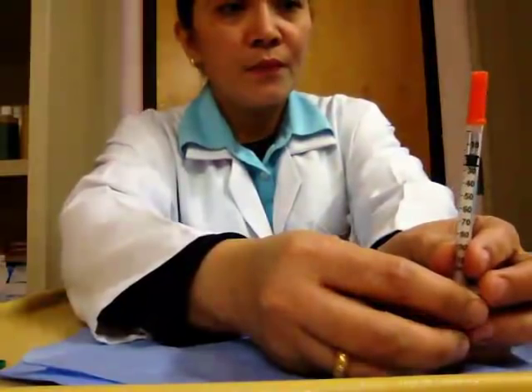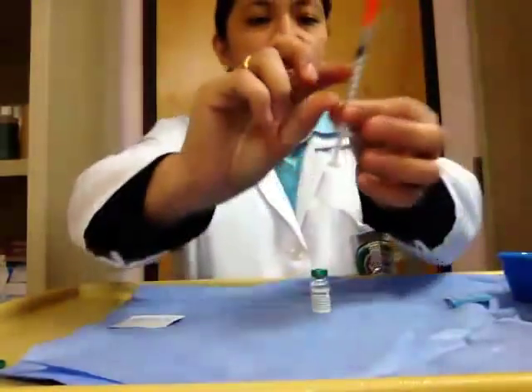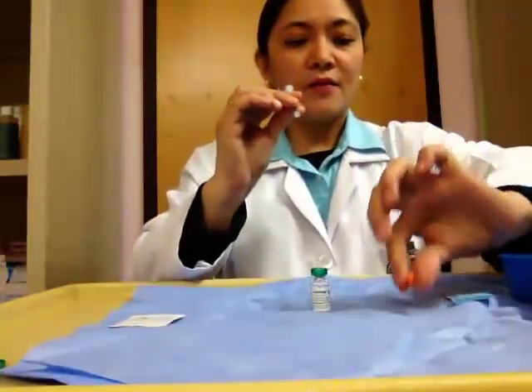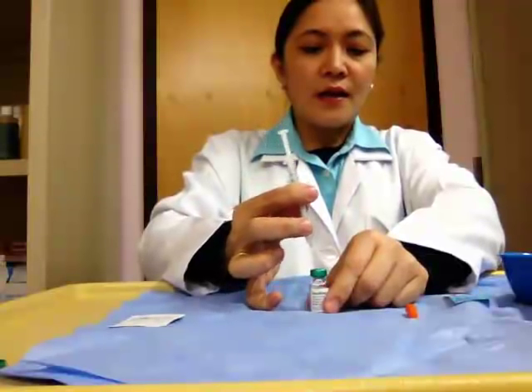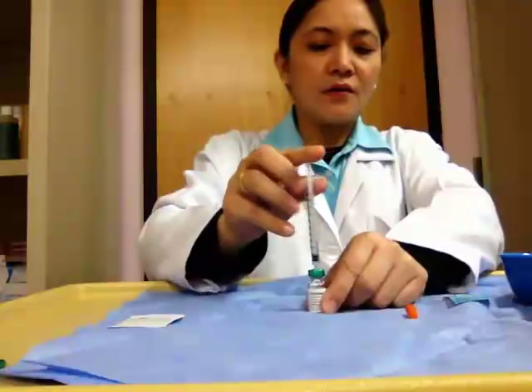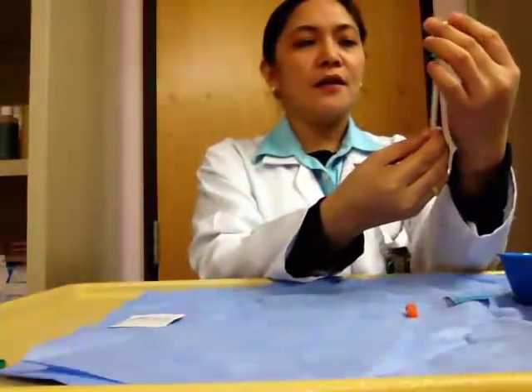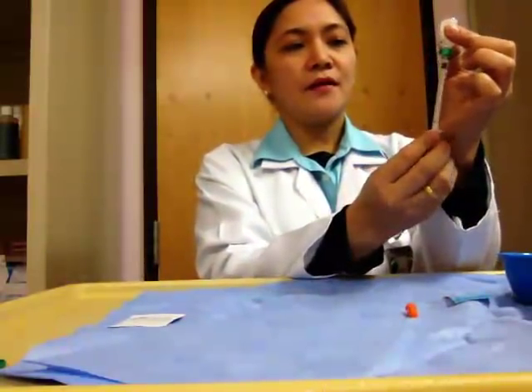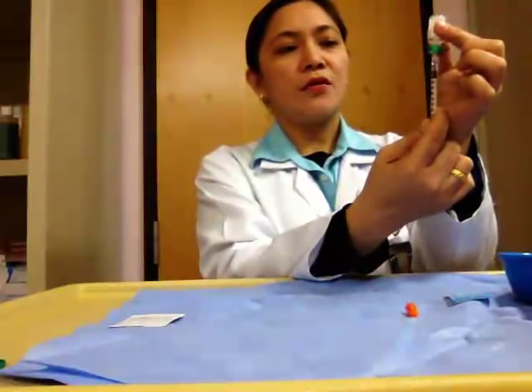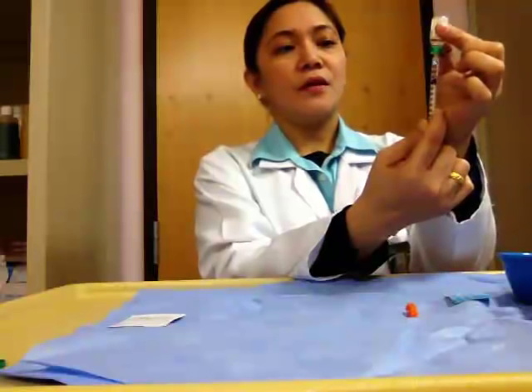Let's say 20 units of insulin. So you will place the plunger at the 20 unit calibration, with the air to be injected inside this vial. Then remove the cover of the needle and inject the 20 units of air into the vial. Invert the vial and get the desired amount of medication, which is 20 units.